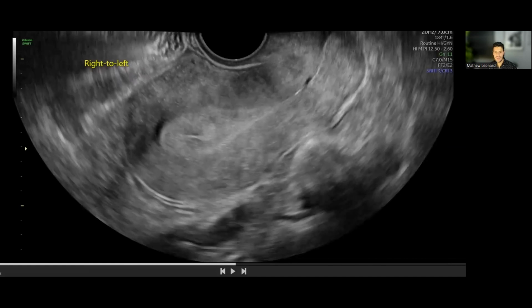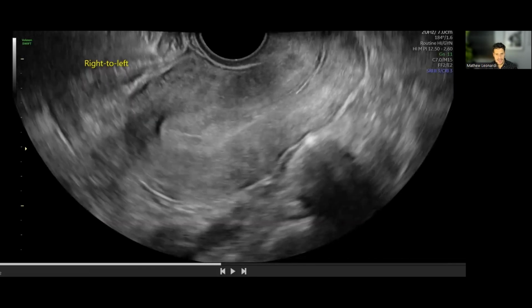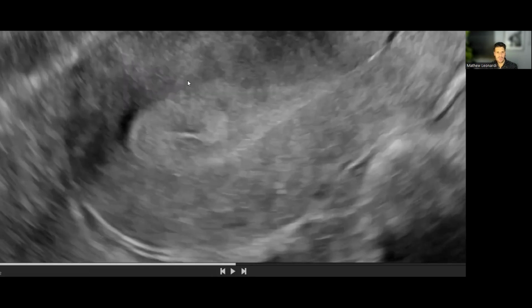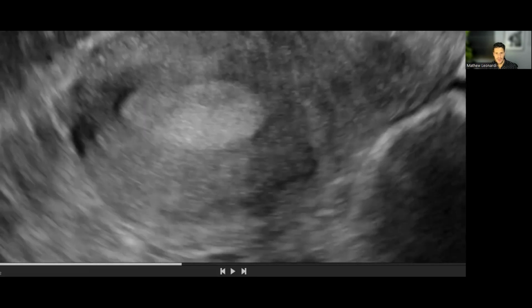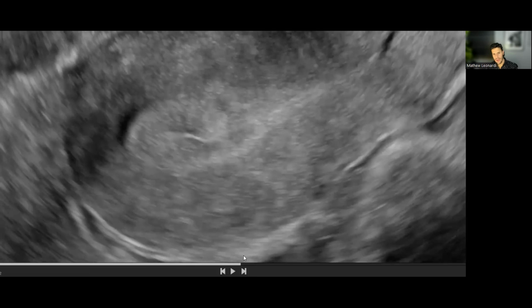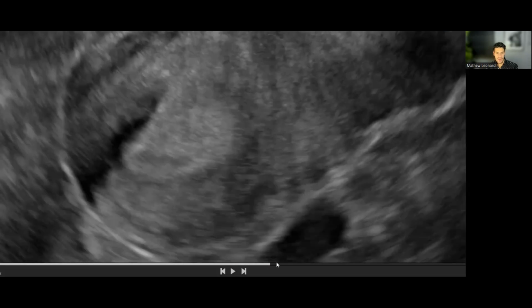Those are direct features. And as I really scan through and critically assess for subendometrial buds and lines, I usually will zoom up a little bit to do that. And so I'm just watching that contour around. And it's possible that right here, we're getting a very subtle change in the shape, in the line. If we were to draw a line across there, we're getting a bit of an interruption. This is very subtle.